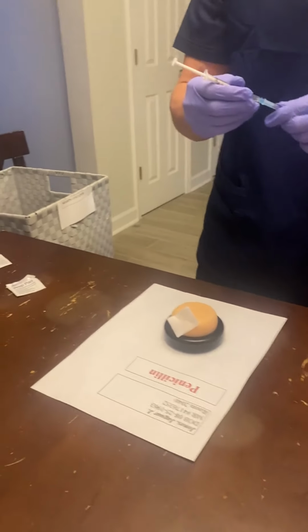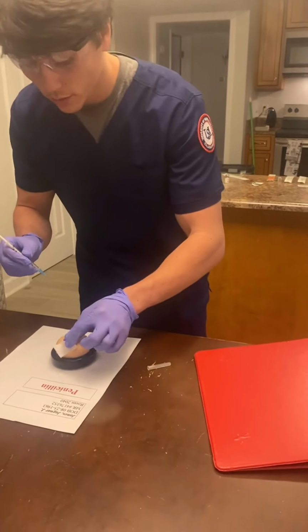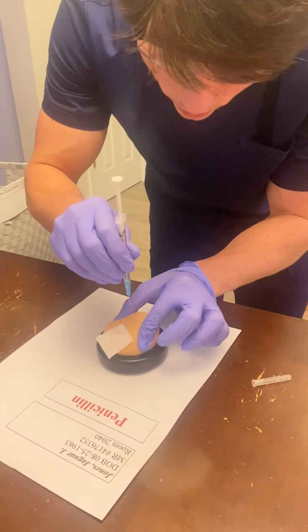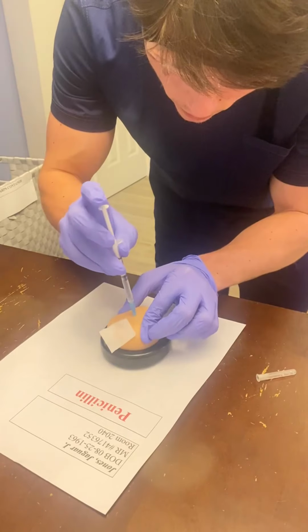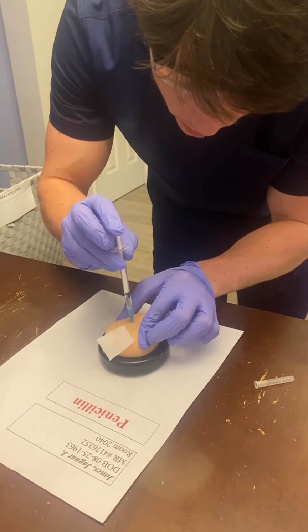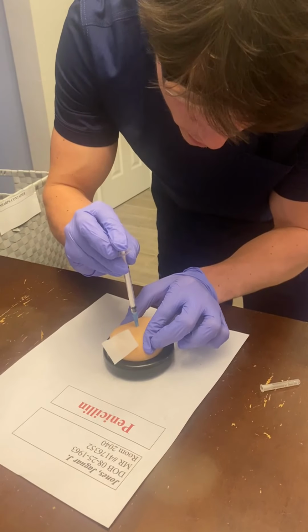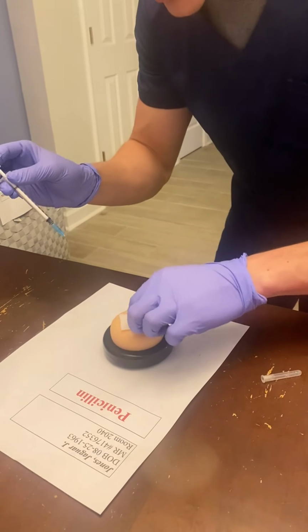And now, when I inject this, I'm going to be going at a 90-degree angle because I have enough subcutaneous tissue. I'm going to pinch the skin, and I'm going to inject the medication slowly so it doesn't irritate the patient. Then I'm going to apply pressure.